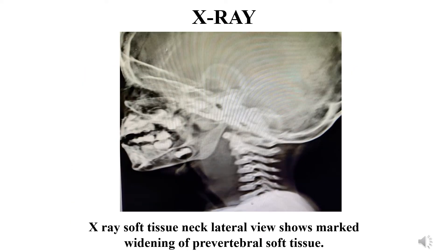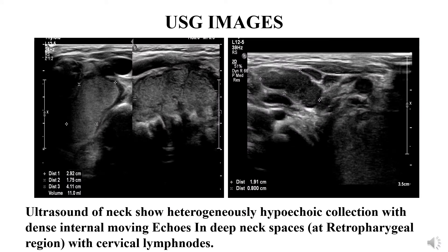X-ray soft tissue neck lateral view shows marked widening of prevertebral soft tissue. Ultrasound of neck shows heterogeneously hypoechoic collection with dense internal moving echoes in deep neck spaces at retropharyngeal region with cervical lymph nodes.